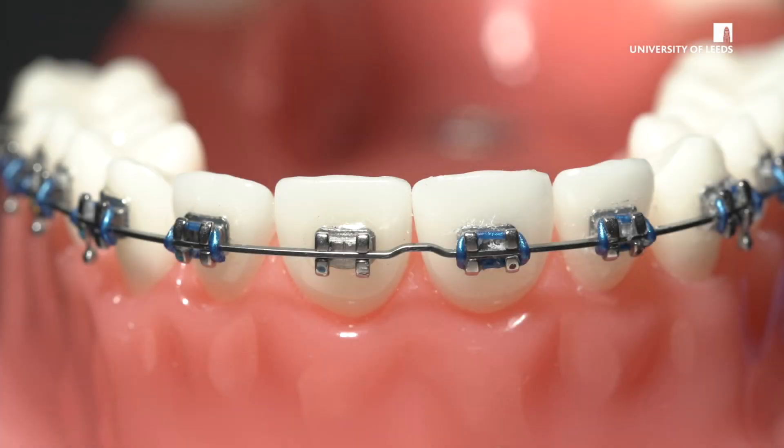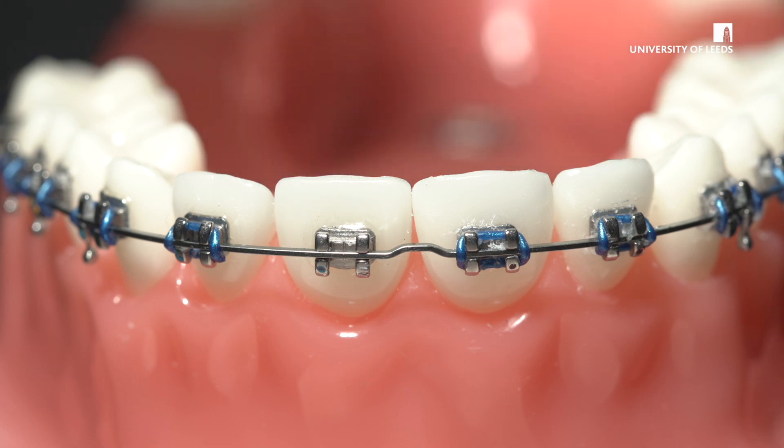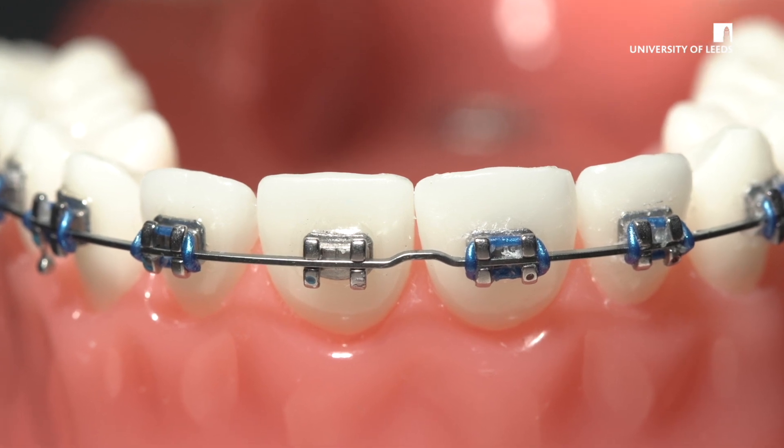In this video we're going to describe how to replace a lost elastomeric module. A patient may attend with an elastomeric ligature that has come away from the bracket. If the wire has become displaced, it would be worth reviewing the other video in the series about how this can be managed.